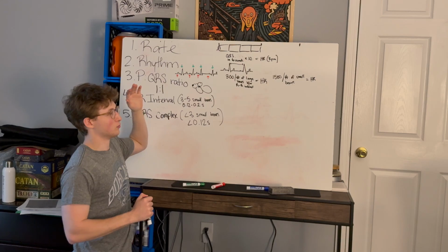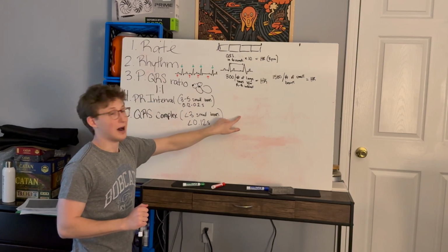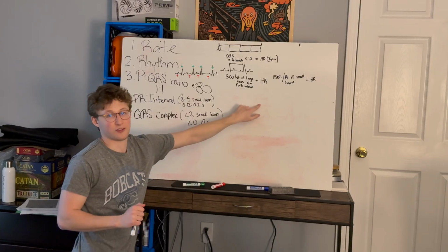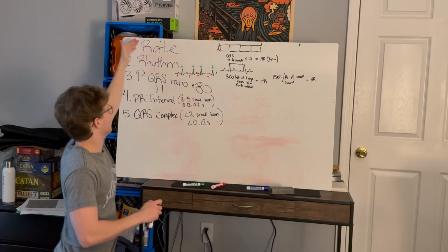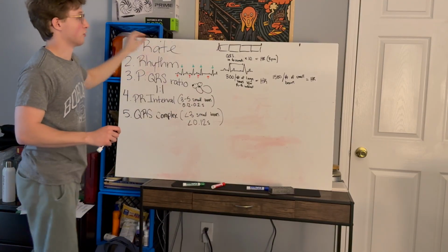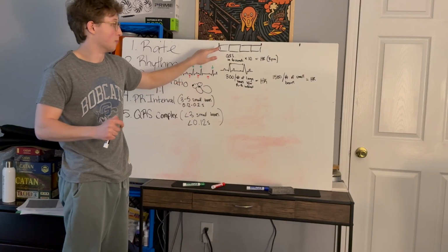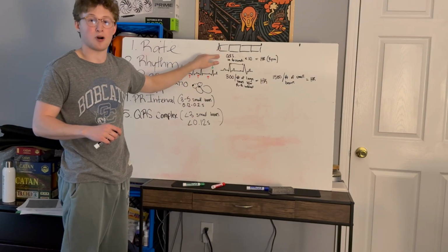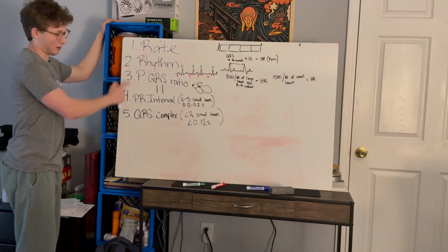Refresh about the conduction system in the heart and why that produces the picture we see looking at lead 2, looking at normal sinus rhythm. Then we want to make sure we understand what we're looking at in an ECG in terms of timing. Our big box is 0.2 seconds, our small box is 0.04. And then we have our 5 steps.